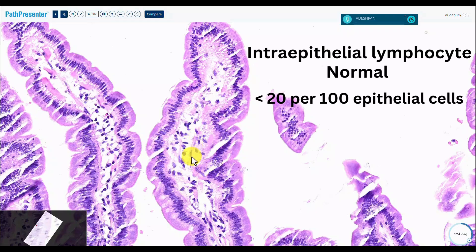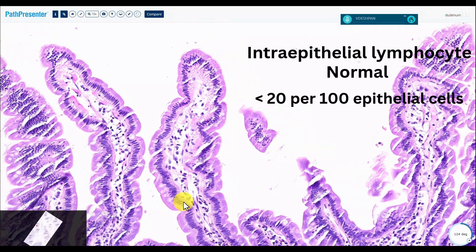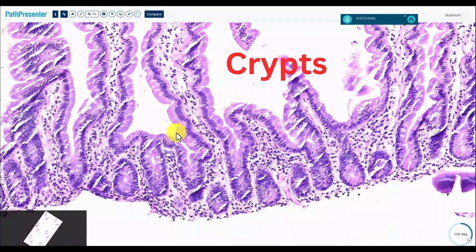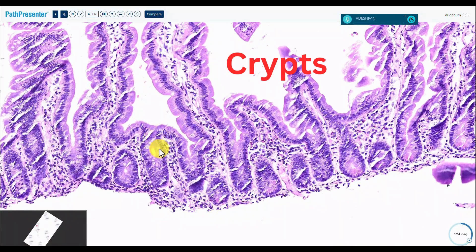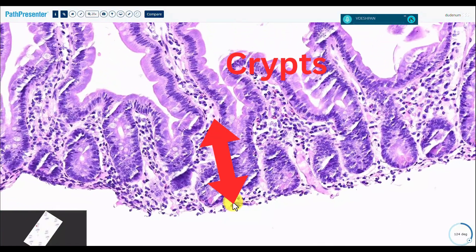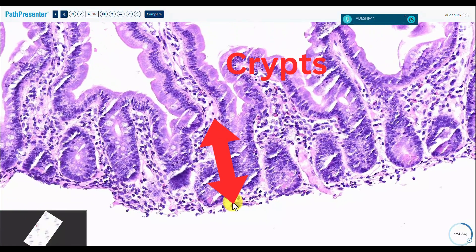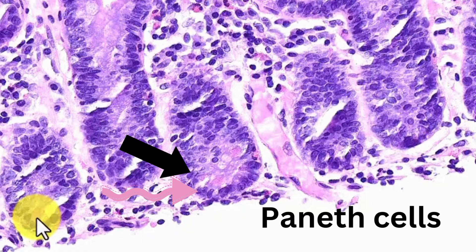You'll see a few muscle fibers in the lamina propria here. Here are the goblet cells. Let's look at the crypts themselves — this is the crypt, much, much smaller. The crypt cells always look a lot darker. At the very base, you'll have cells with apical granular cytoplasm and brick-red granules.